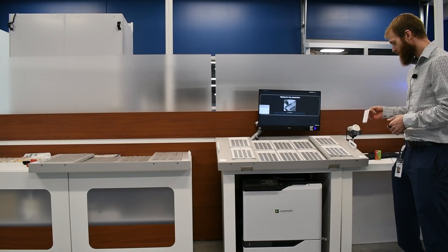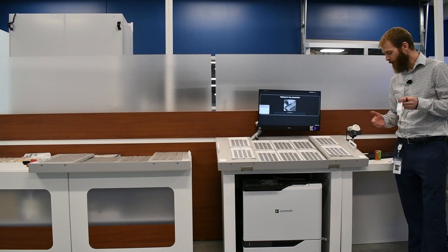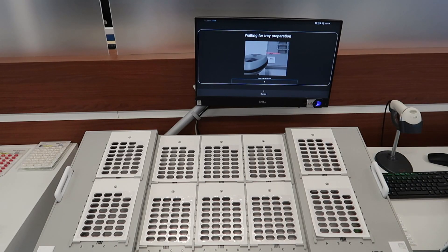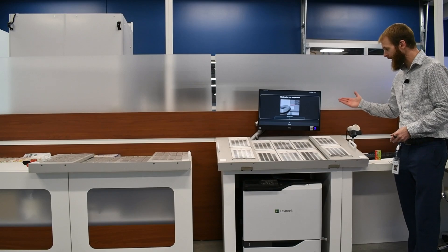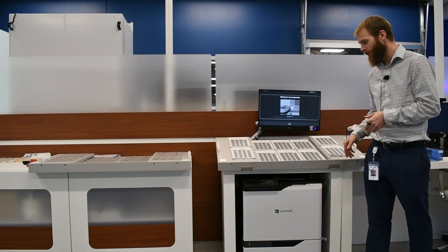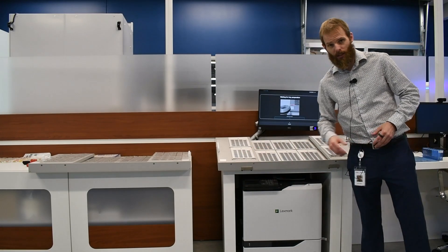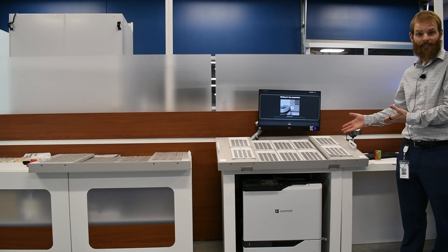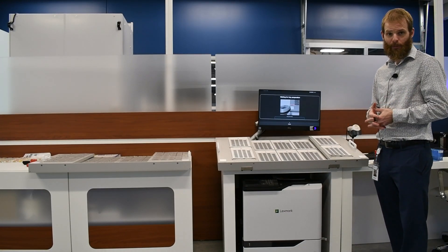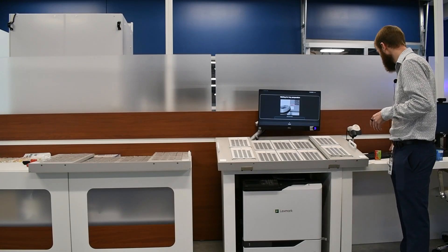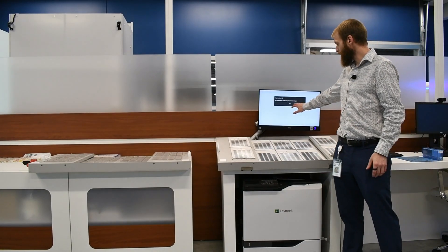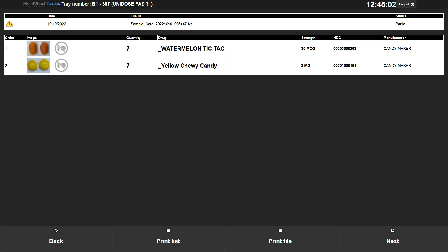After printing the labels and applying them to the tray, the technician will scan one of the tray labels. Each one of these trays also has a card label on it. That card label lets our system know which cards you have in that actual tray, so we know how to display the information and fill the card appropriately. Scanning that tray label will populate a list of the drugs needed for the cards on the tray.